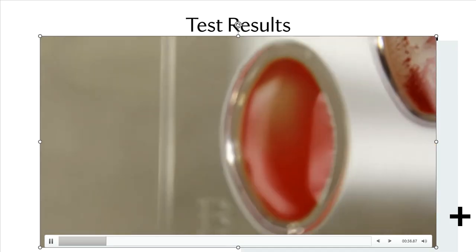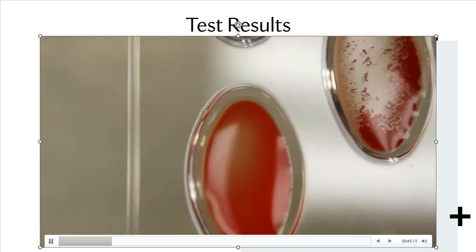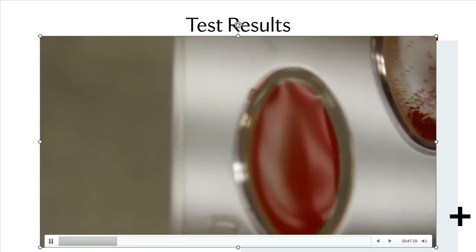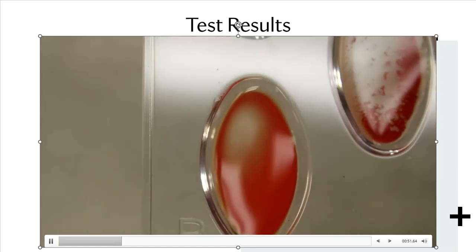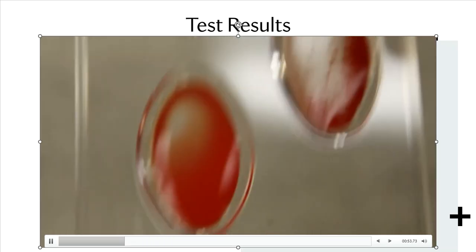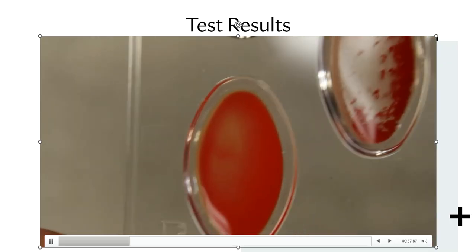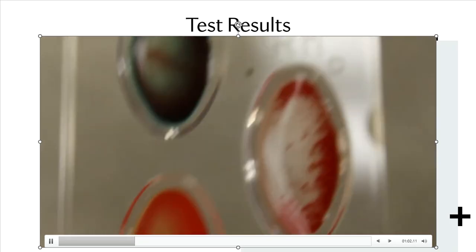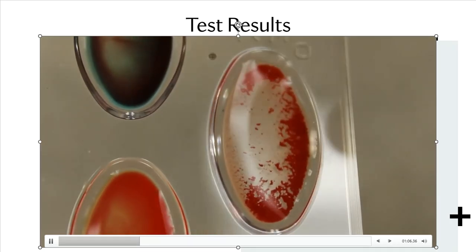All right, well, if I go down to B and do the same thing, you can see B a little bit better. It's very watery, it's very uniform, there's no clumping going on at all, and that probably means that I am not blood type B either. So I am not A and I am not B, which means that I am blood type O based on this particular test. And then finally, this is what an actual positive sample is going to look like.